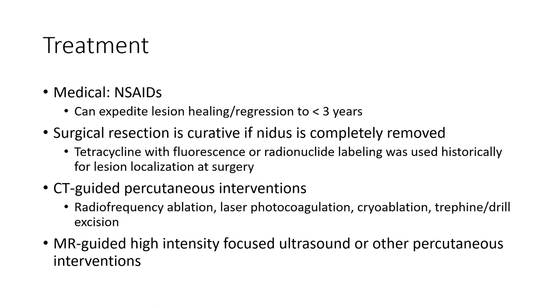Tetracycline with fluorescent or radionuclide labeling was used to aid in lesion localization at surgery. CT guided percutaneous intervention: radiofrequency ablation, laser photocoagulation, cryoablation, and trephine drill excision. MR guided high intensity focused ultrasound or other percutaneous intervention.